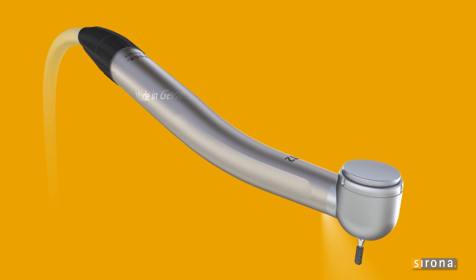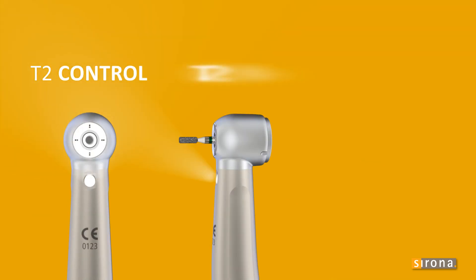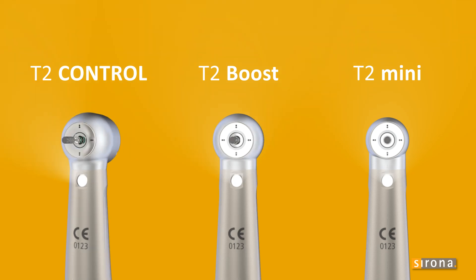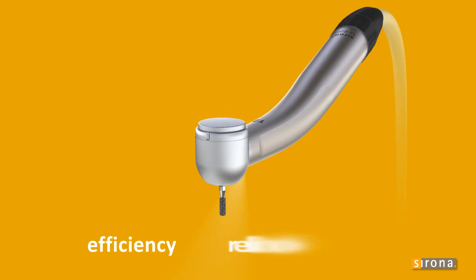Featuring cutting-edge technology and the finest quality — in short, Sirona. Quality made in Germany. T2 turbines are the durable range in the comfort class, offering the options control, boost and mini. Quality and Sirona know-how combined to create a product range that ensures comfort, efficiency and reliability.